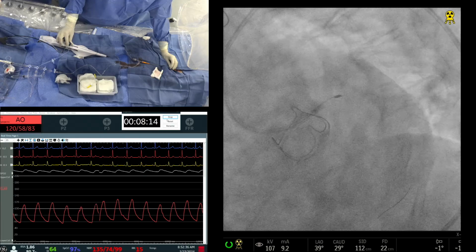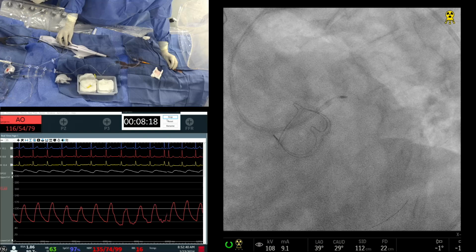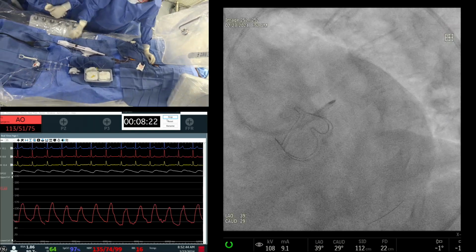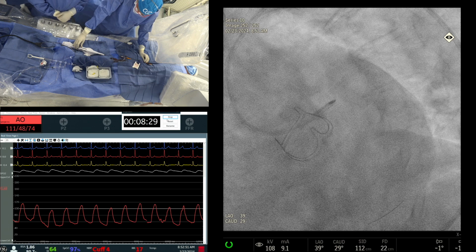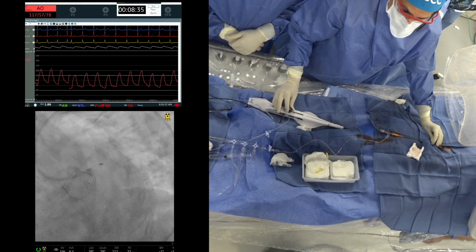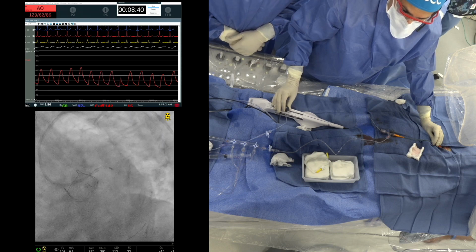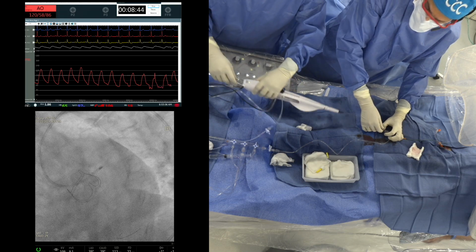Now you saw that I changed the wire position also with the brake release, and that will give a little different bias also. Yeah. Okay, that's cross. Even tweaking the orientation of the guiding catheter would be of help. Here. That is correct. Yeah. Okay. And hemodynamics, you are seeing it here. Okay. I think we start coming out.